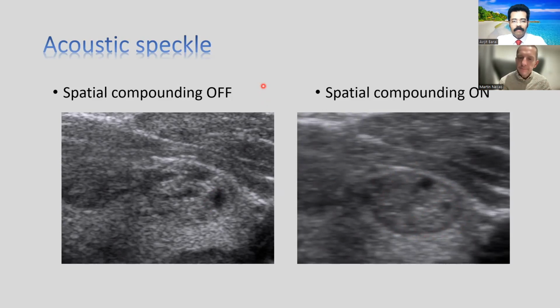Amazing. Thank you. Even the handheld device or the portable devices that we use in our point of care ultrasound, we have got these techniques available, and that gives such beautiful image quality, but that decreases those speckle artifacts. Absolutely. Most machines do this now very happily. And without it, ultrasound really looks terrible without spatial compounding. Yes. So it's incorporated into almost every system available now.